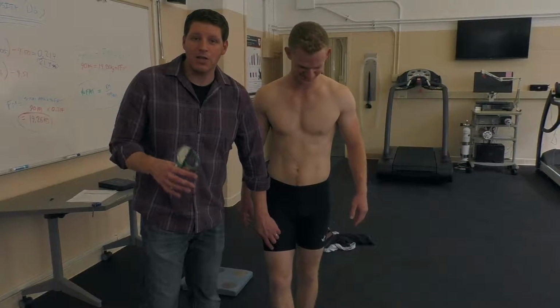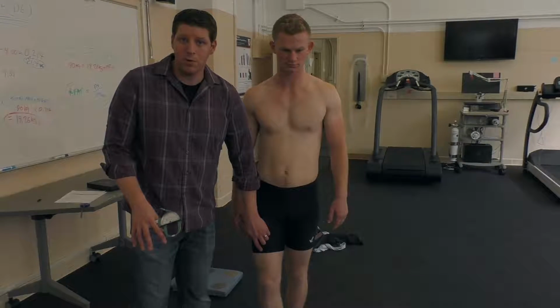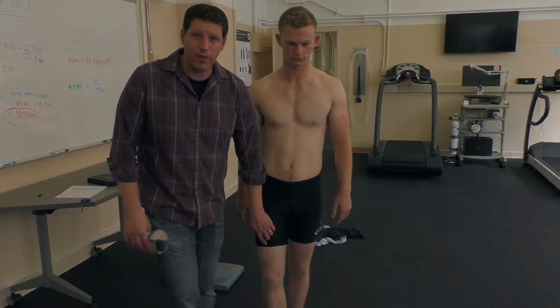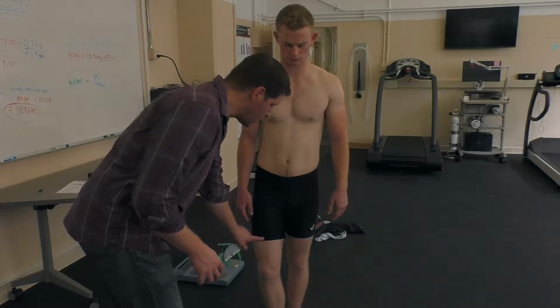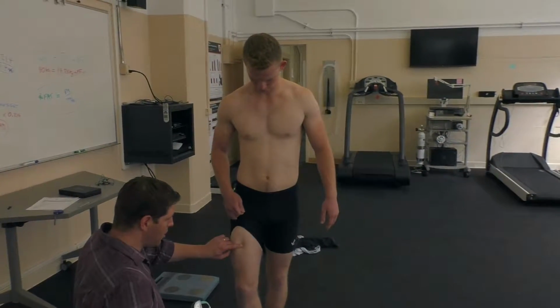Okay. There's a lot of flexion going on in the muscle, so it makes it really difficult to get a good skin fold. But if you ask them to put their right heel on their left foot, that completely relaxes the quadriceps and allows you to get that skin fold. So you mark that area, ask them to pull up their compression shorts if need be.